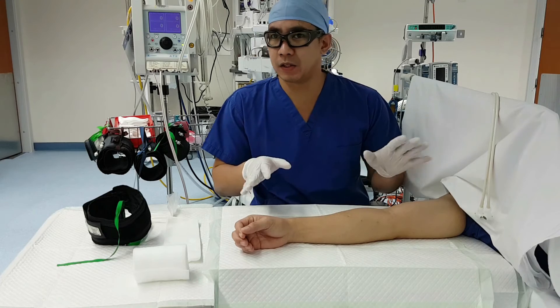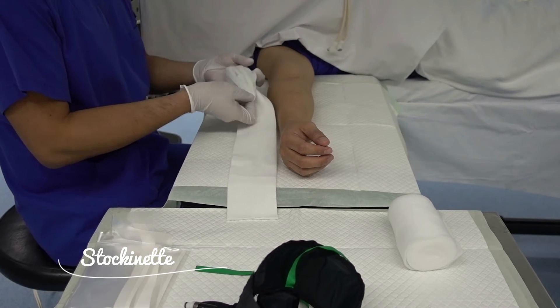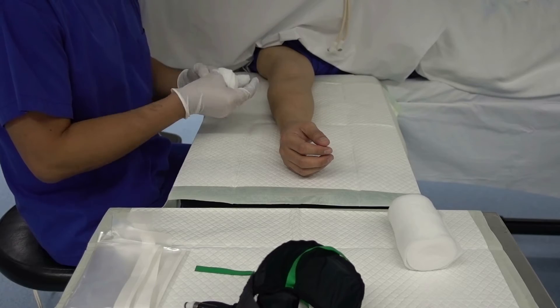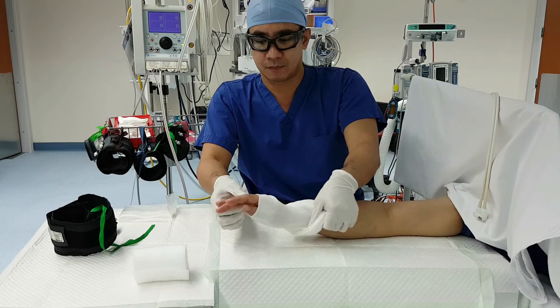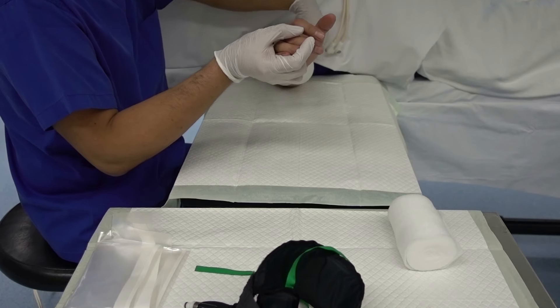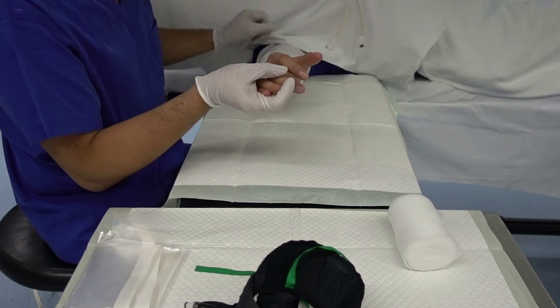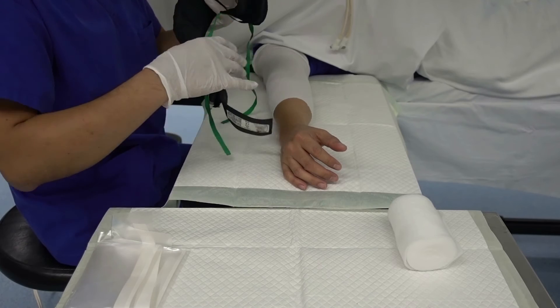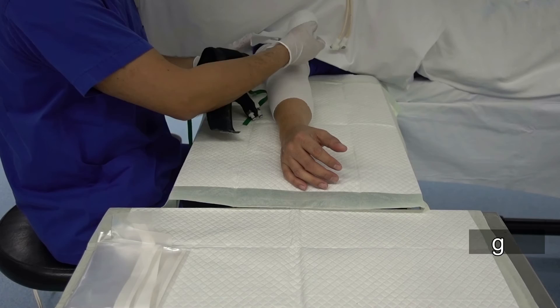So let's now apply the tourniquet to our patient. First, select an appropriate size and length of stockinette. Inspect the skin integrity of the patient where you're going to place the tourniquet. Roll the stockinette and slide it down the arm of the patient. The padding should be wrinkle-free and not pinch the skin. If you don't have the appropriate stockinette size, a low-lint wool soft padding should be applied around the limb.